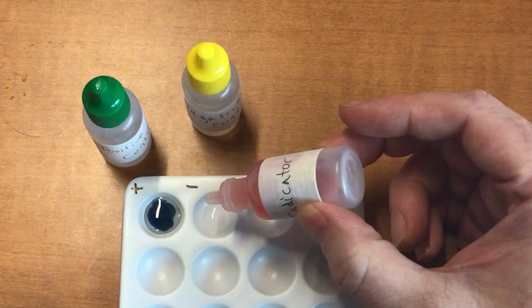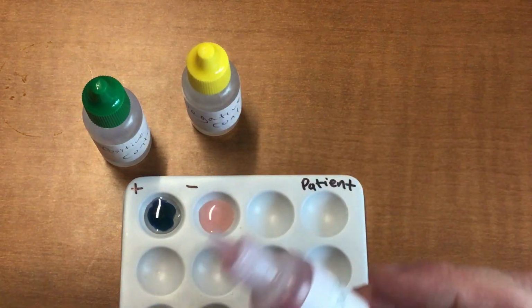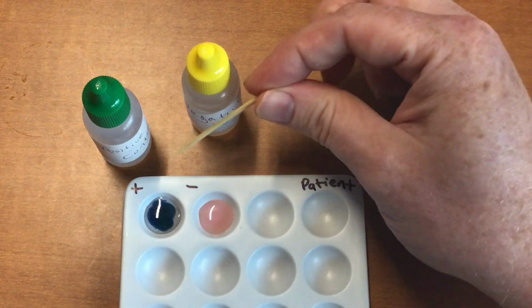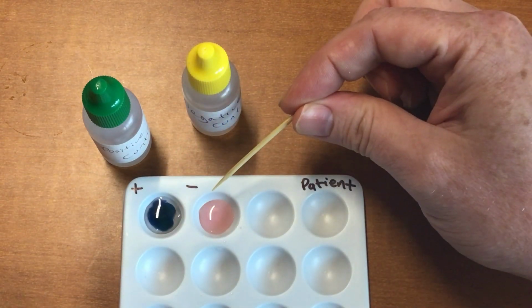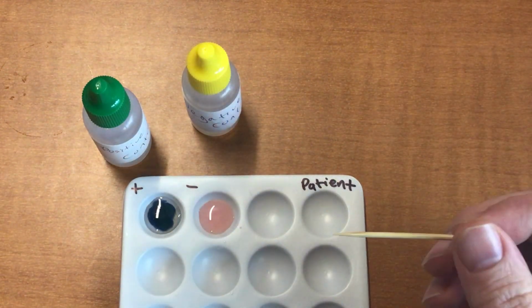And then when you pour it into the sample that does not have salmonella, that's going to stay pink. So now you can see a clear difference between the sample with salmonella and the sample without salmonella. Right? So that's what it looks like to have salmonella, and that's what it looks like to not have salmonella, or whatever disease you're testing for.